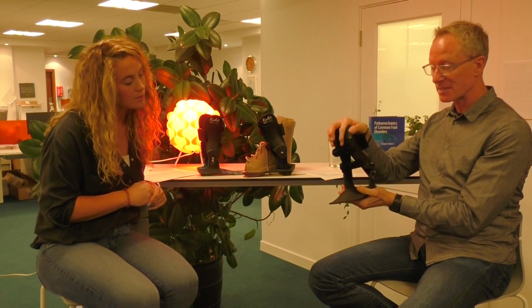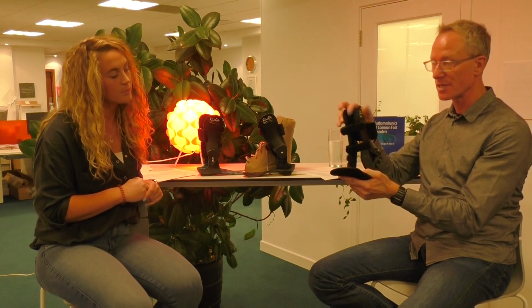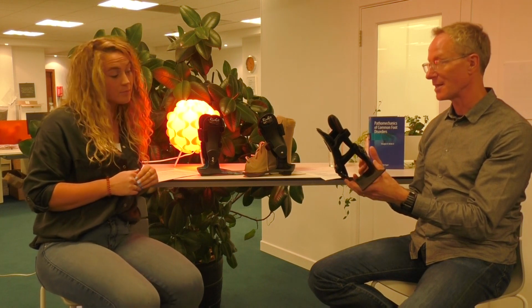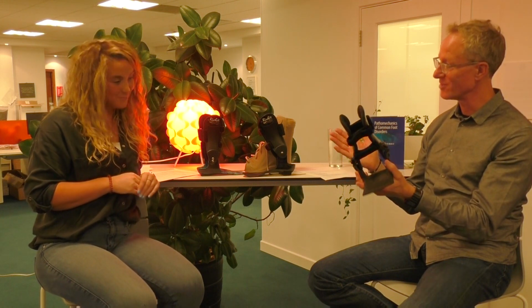The dynamic assist is with a Tamarack hinge, and this is a Tamarack hinge, this little gadget that actively dorsiflexes the foot in the swing phase of gait. So this is used for flaccid foot drop. Yeah. And it can be very, very effective. Yeah, it gives 15 degrees of dorsiflexion. Perfect. And anything from 10 to 15 is very good.